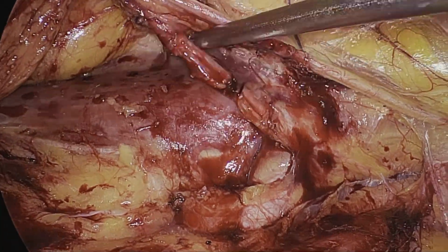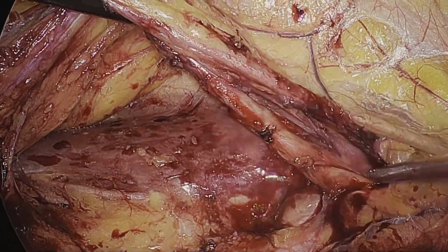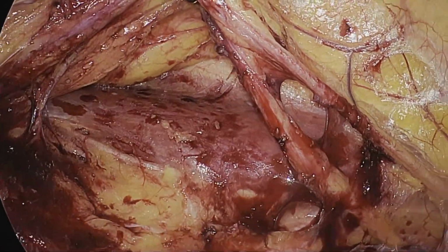Below we can see the left side common iliac artery, and above here we have the ureter-gonadal complex. We have separated the ureter and the gonadal vein here.